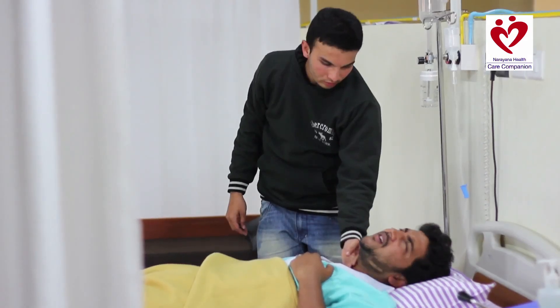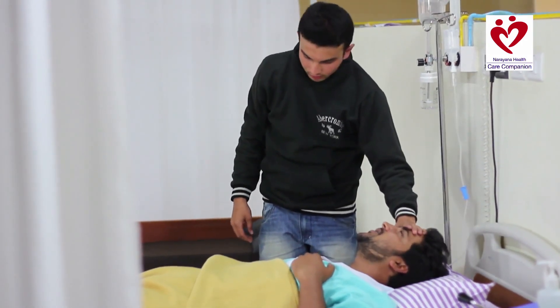Taking temperature is important because an abnormal temperature can be an indication that the patient has a fever or an infection. Learning this skill can help you prevent an emergency for your loved one.